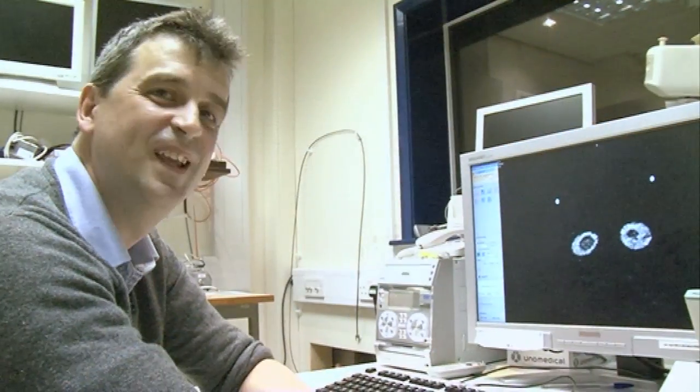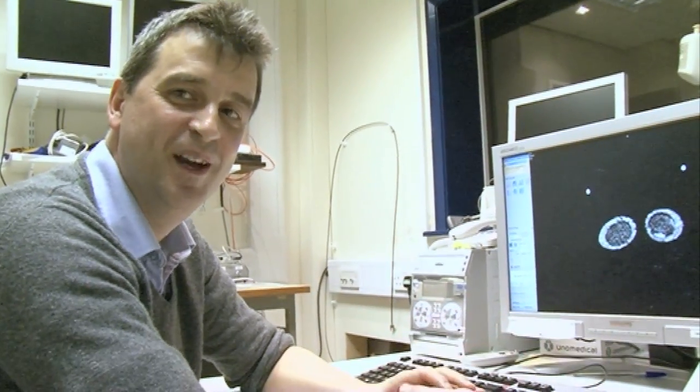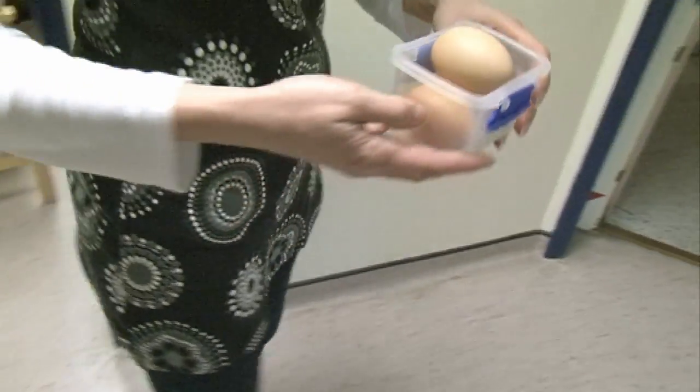Have you ever imaged a cream egg before today? I have to say I haven't, so it's a new experience for me. We thought it would be a good idea to also look at some real eggs as well as cream eggs to see what we can see. There we can probably differentiate the yolk from the surrounding egg white, so let's have a go at doing that.